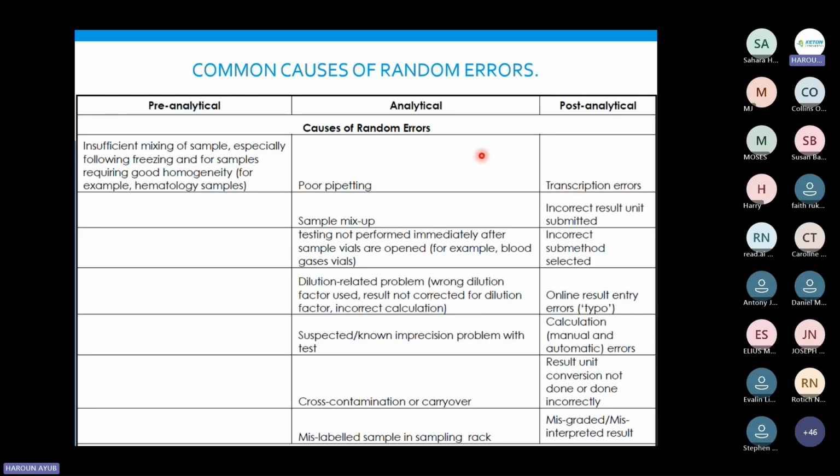Now what does it do? It goes into the liquid now. So when it goes into the liquid, AST will pass. Another analyte will pass. Another analyte will pass. Another analyte will pass. But ALT will give you very wrong results because it aspirated air, so the reaction was happening between reagent 1 and reagent 2 without the sample. You might wonder what happened, but when you do a rerun next time, you find that it's correct.